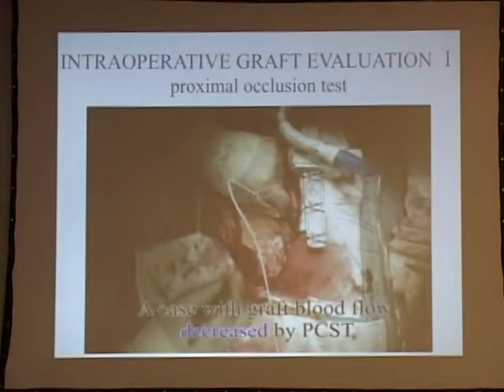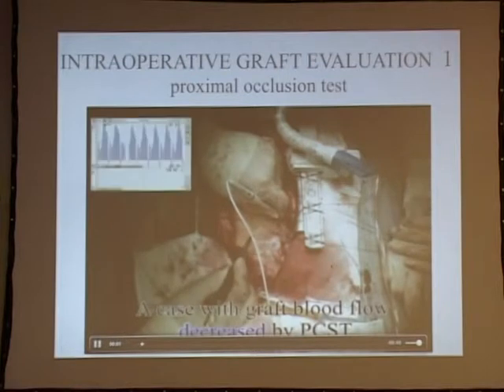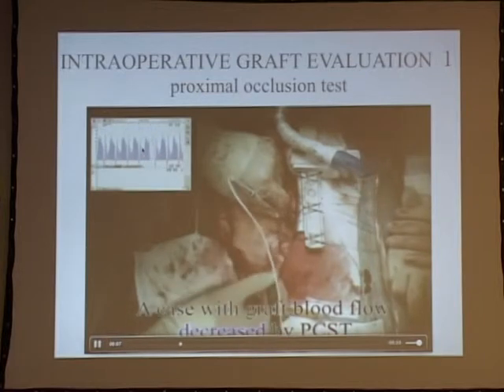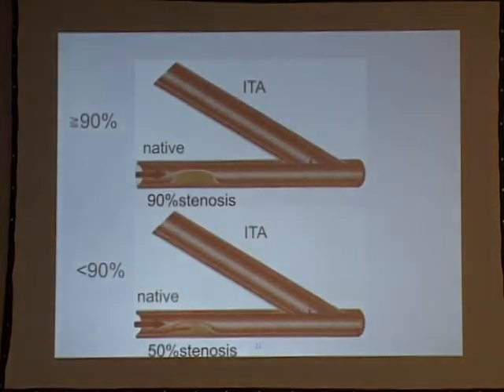This is some sample. You can see the flow meter here. I occlude the native, the flow decreased. This is another one, sorry.